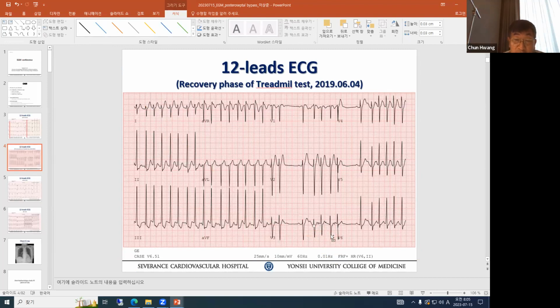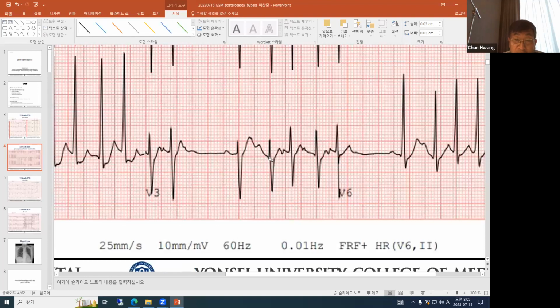이게 좀 크게 보여야 될 거다. Yes, there we go. Let's measure. R to P. 그 정도. 그 다음에 move on. No, you're measuring wrong there. The R, yeah. Okay. 조금 더 와야지. Yes. I think they're different. They're not same.